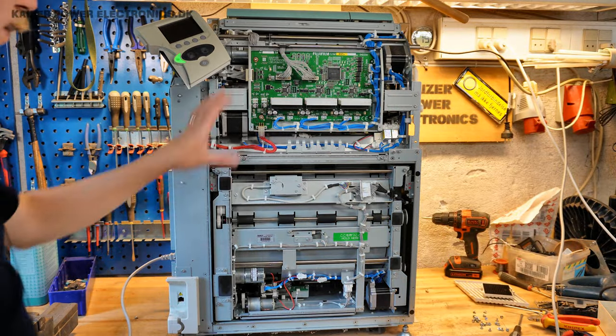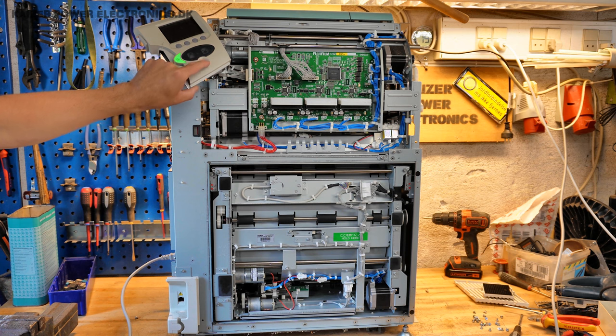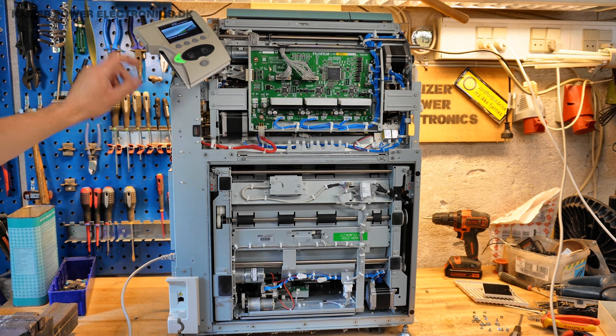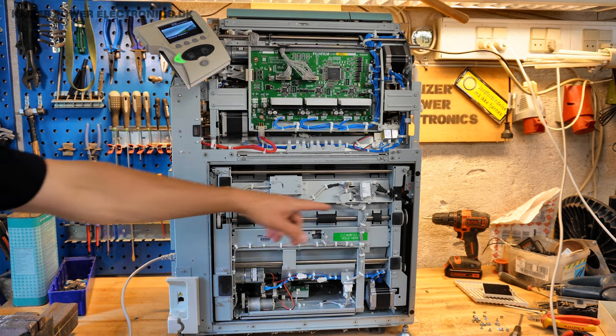Maybe we can see some motors moving here in its initializing sequence. It's running some initialization, and there's certainly something running around over here.